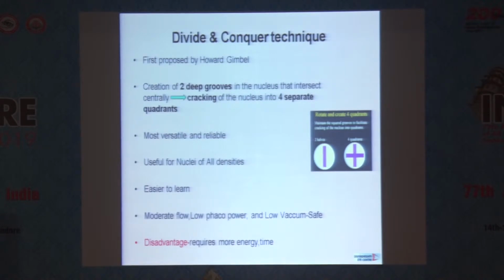Divide and conquer technique is one of the basic steps, and I think that all the basic surgeons or initial surgeons should adopt this technique, because the advantage is that whatever you are doing is in a very controlled manner under direct visualization. The vacuum is very low, so there is no turbulence in the anterior chamber, and whatever you do, you just see it and do it, and it is done in a very gradual and smooth manner, and though it takes time, it is very essential to have some confidence.